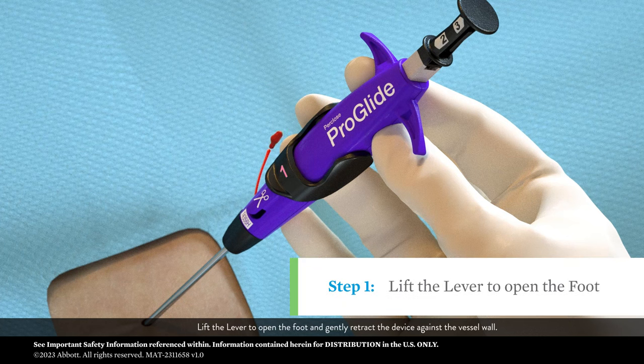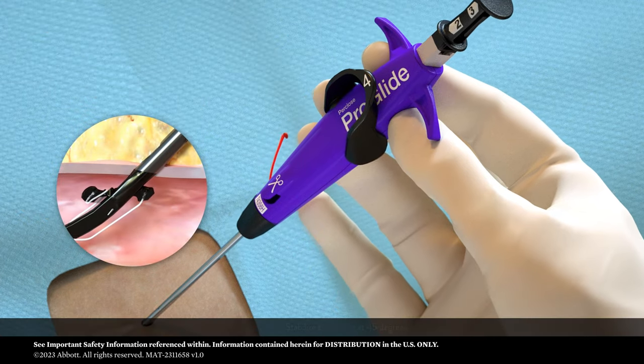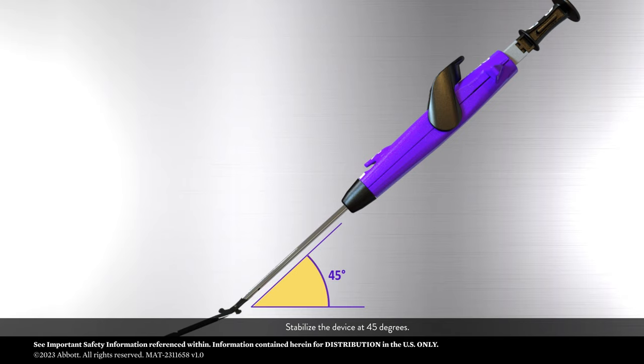Lift the lever to open the foot and gently retract the device against the vessel wall. Stabilize the device at 45 degrees.